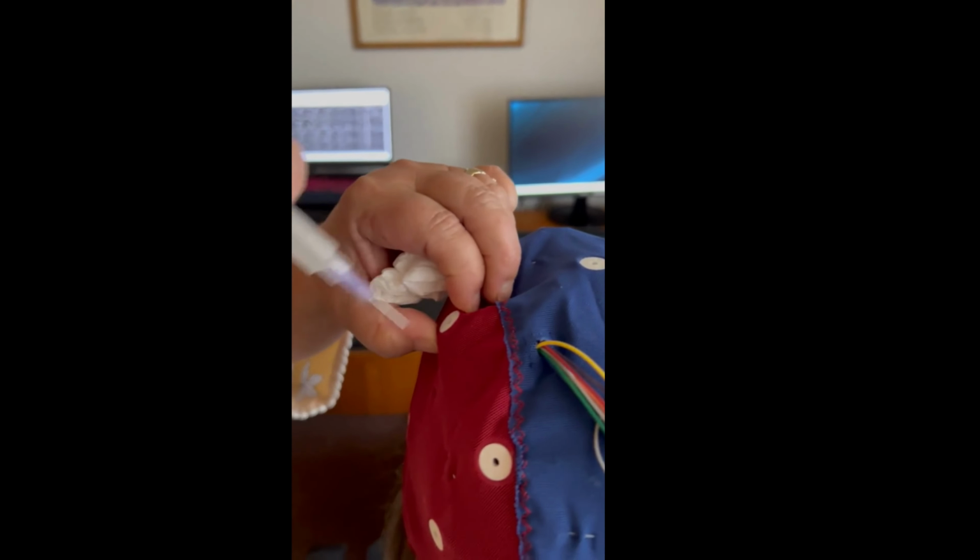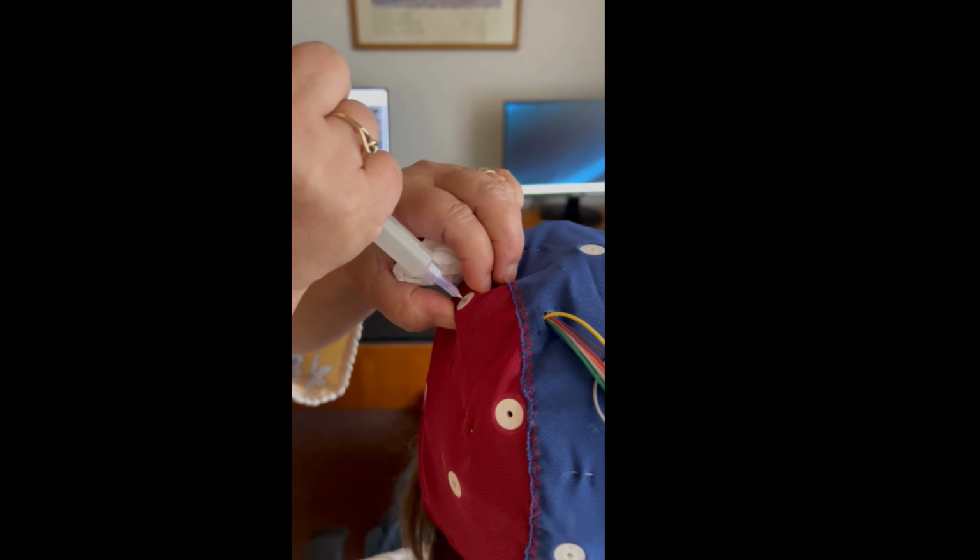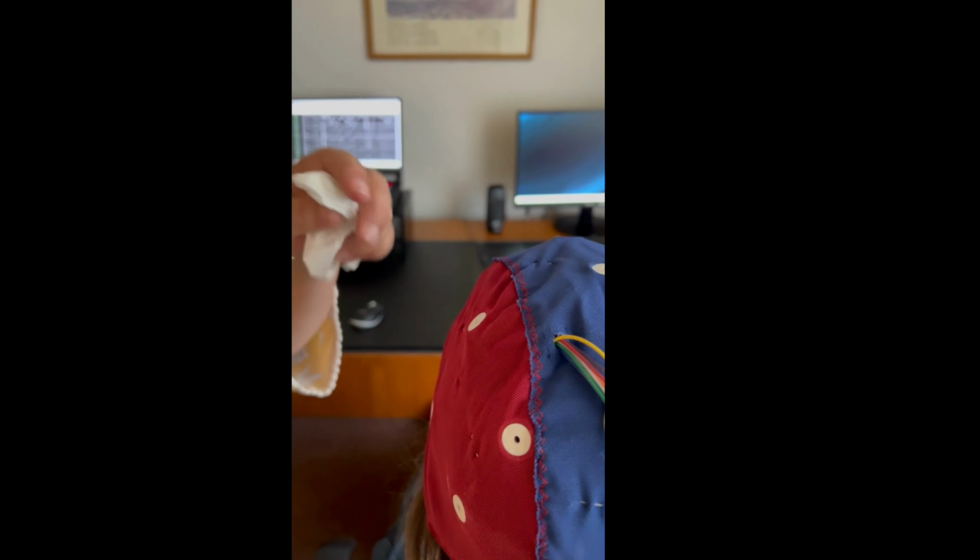So we rocked it back and forth with our fingers. We used the Q-tip. Now we're going to insert just a little bit of gel. There is such a thing as using too much gel, so you want to be careful not to put too much in. So we want to lift up the electrode, just squeeze a little bit of gel in there. And then once we do that, we're going to go ahead and move the electrode around a little bit again, just giving it a rock back and forth like we did before.